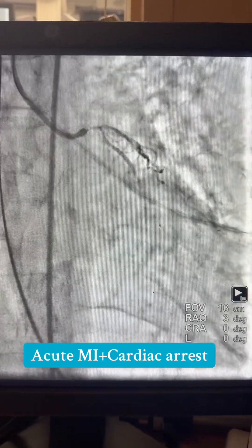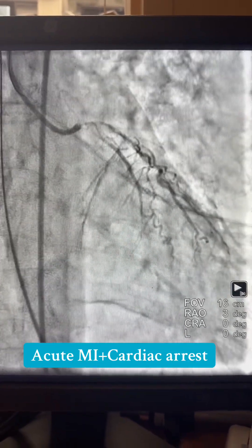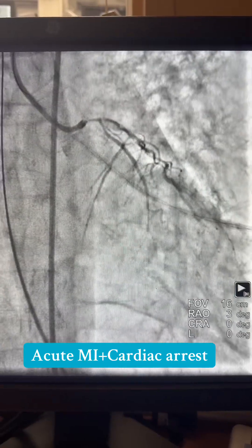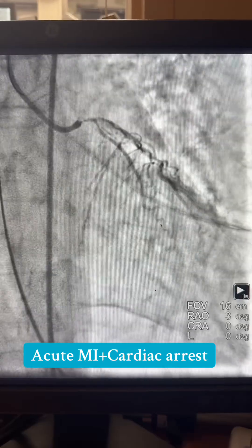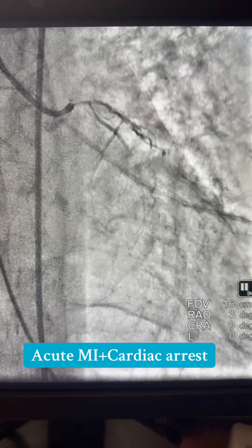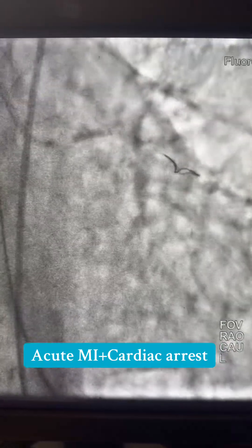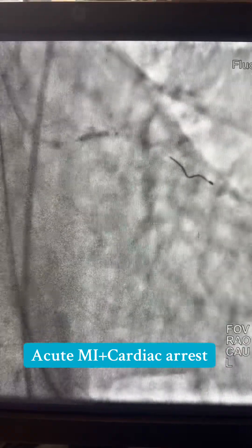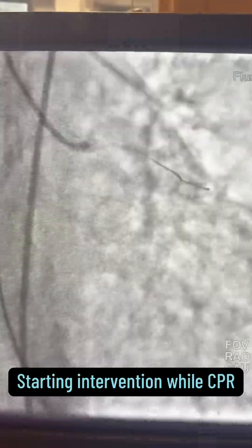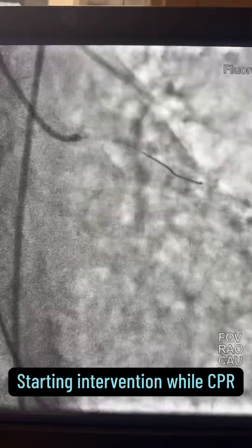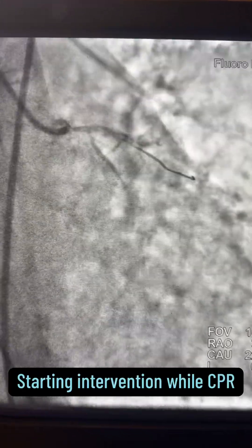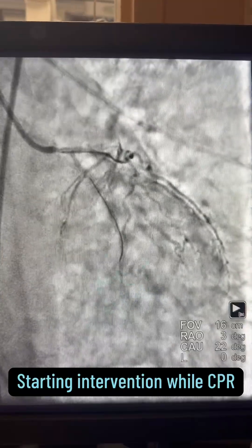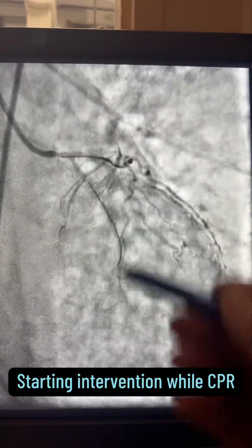This is the angiogram taken between CPR compressions — I'm doing CPR, then performing the angiogram in between. I obtained access and used the JL3.5 guide. I then passed the run-through wire and performed a fast balloon inflation. Here is the angiogram now — you can see some flow in the LCX and the LAD.